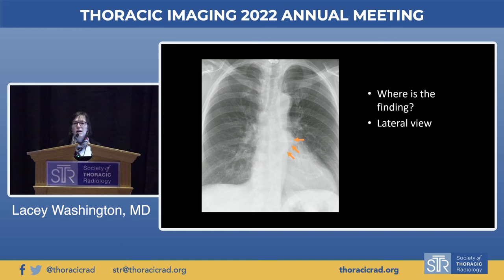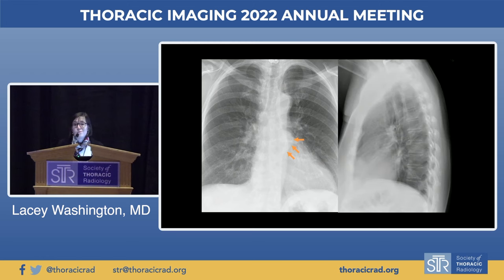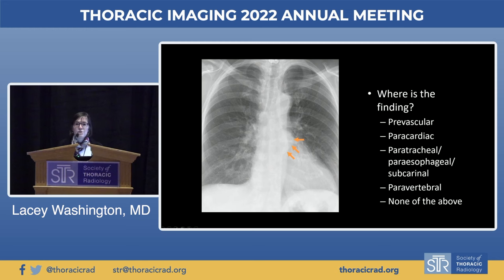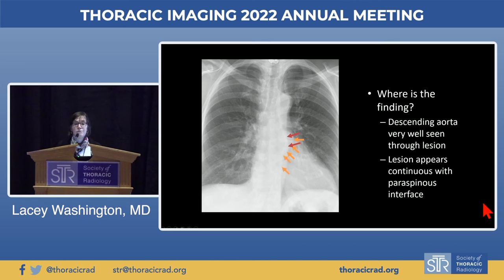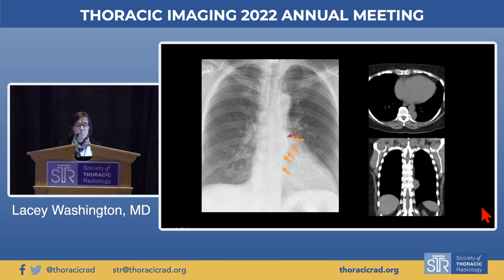On all the other cases the lateral view has been really helpful, but when lesions are small, the lateral is not necessarily helpful at all. To localize this finding: the descending thoracic aorta is well seen right through the lesion, but the lesion appears continuous with the left paraspinous interface, suggesting a paravertebral lesion. On CT — both axial and coronal images — you can see this paravertebral lesion is a nerve sheath tumor, the most common paravertebral mass, much more common than extramedullary hematopoiesis.